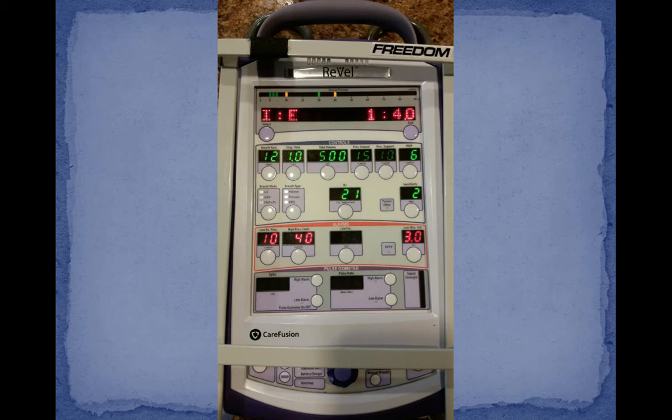Notice a respiratory rate of 12, inspiratory time 1 second. That creates an I:E ratio, as you see on the screen, of 1 to 4. That's a good I:E ratio. Tidal volume of 500 with a PEEP of 6.